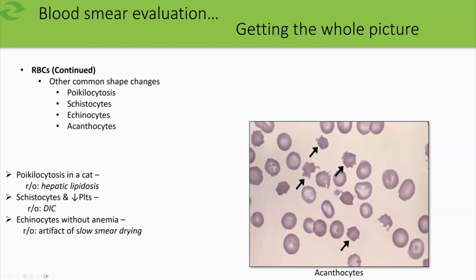And then acanthocytes, which we touched on a little bit earlier, are characterized usually by 1, 2, sometimes 3 blunt projections. A colleague of mine calls them the Shrek cells, and I think that one kind of looks like Shrek. I think my son would probably agree on that.